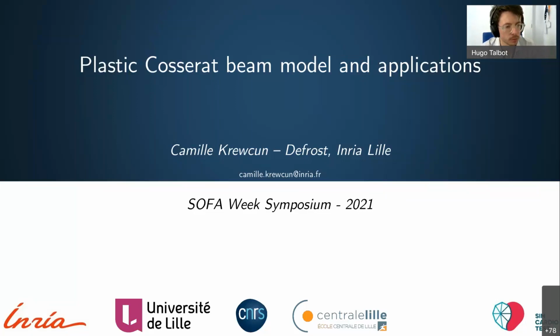Yeah, about the plastic threshold, basically you have two options. Either you have very simple materials, not like the structures I was showing here, and then the plastic threshold is something that is documented in literature, for instance, for classic metallic alloys. But obviously, when you're considering complex structures such as electrodes or leads, which internally are way more complex than just a metallic wire, the idea here is to use a homogenized model and to tune this model thanks to experimental measures, for instance, in uniaxial tensile tests or bending tests.